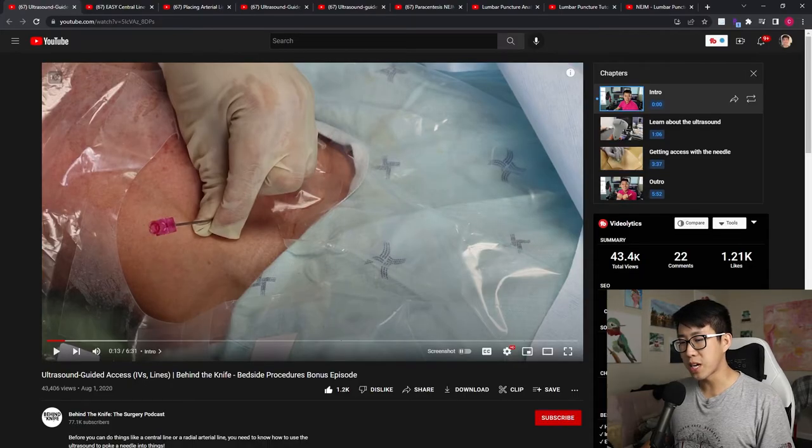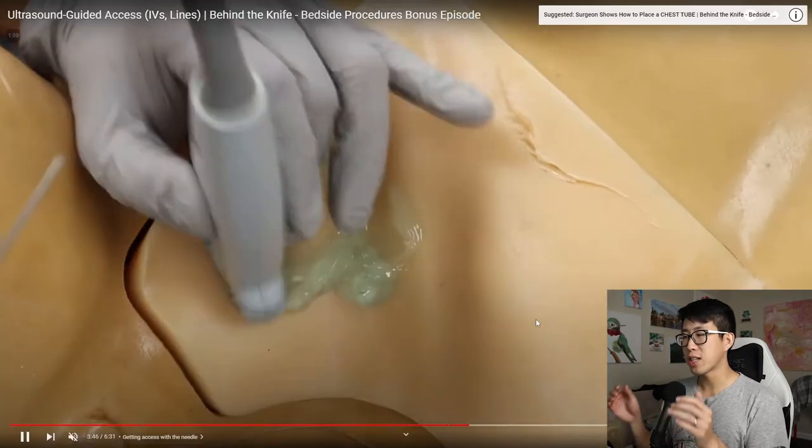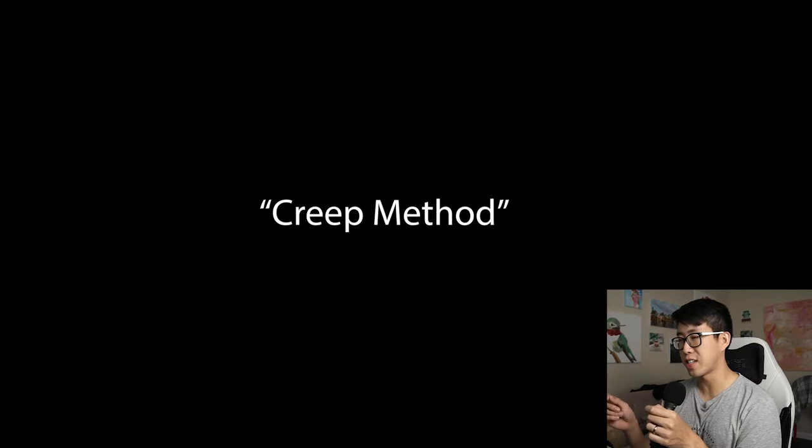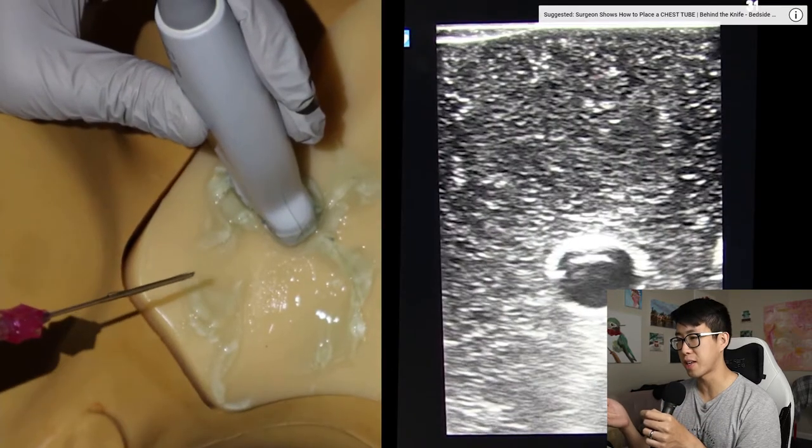The first video is made by the people from Behind the Knife, the surgery podcast. This first one is really just a primer on getting ultrasound guided access. What I really like is that in this video they demonstrate the way to advance the needle along with your ultrasound probe - they call this the creep method.